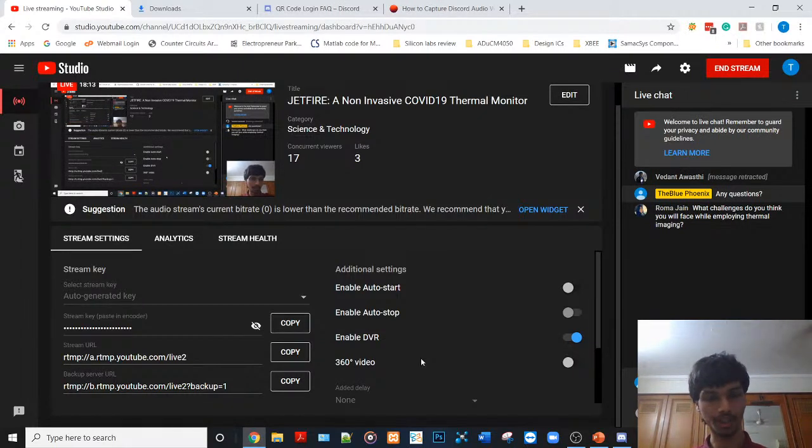We have tried to solve that by researching a lot, and we have found that 320 by 240 pixel thermal cameras are pretty useful in medical imaging, and there has been a lot of work going on in using these resolution cameras in detecting tumors and skin lesions. But right now there has been no effort to detect some kind of respiratory or internal disease, so we are trying to use thermal imaging for those applications.